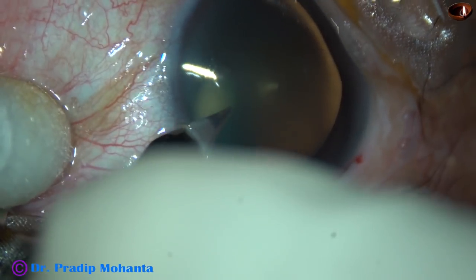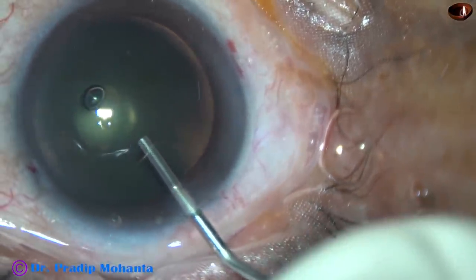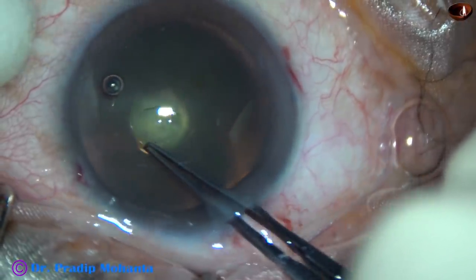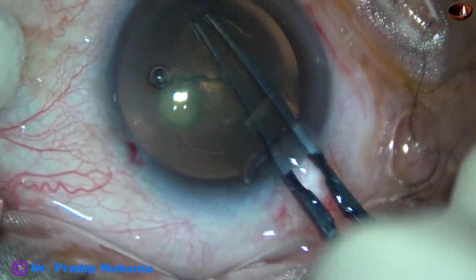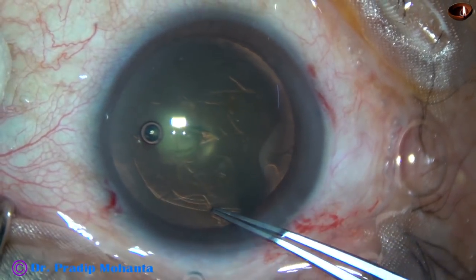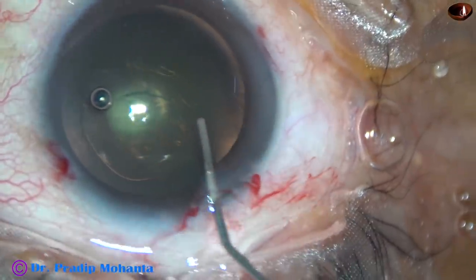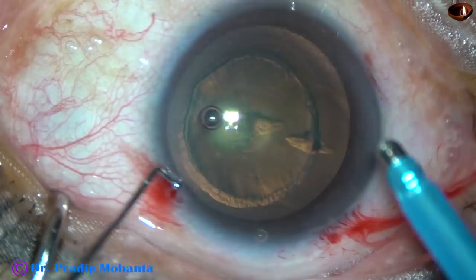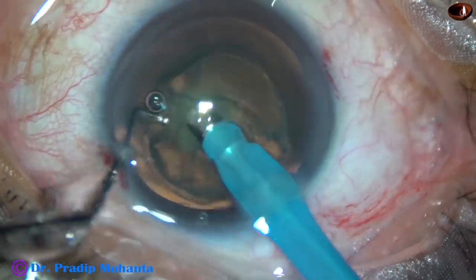By this time the main incision has been made and two side port incisions have been made about 3 o'clock hours away from the main incision. Viscoelastic substance has been used to fill up the anterior chamber and now a capsulorhexis is being done with Utrata forceps. All these are routine steps and this is okay. There is no problem till now. And now I didn't want to do hydro-dissection in this case, so I go deep into the substance of the lens mass and do a hydro-delineation, and remove the central part of the lens mass.